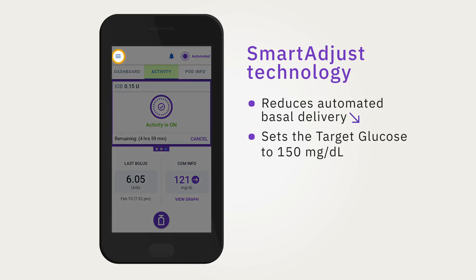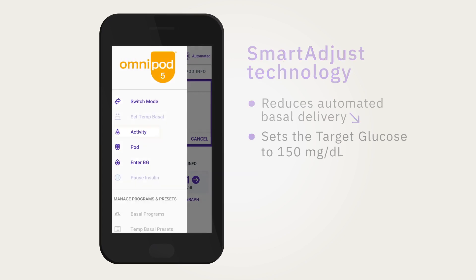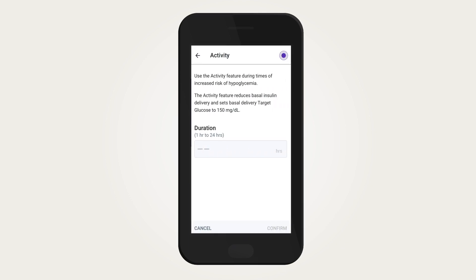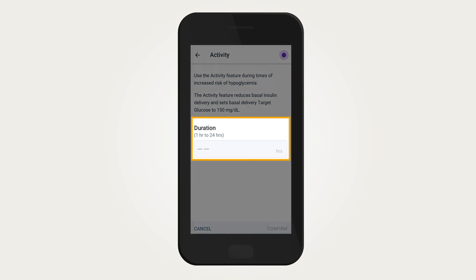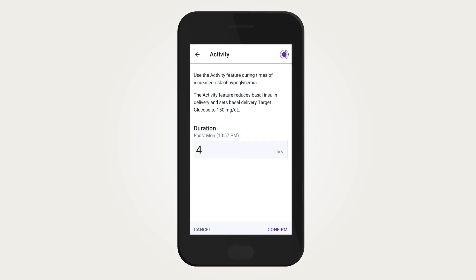To start the activity feature, tap the Menu button. Once the menu expands, tap Activity. The activity feature can be set from 1 to 24 hours in 1-hour increments. Tap the Duration field to enter the duration for the activity feature. Once the activity feature duration ends, the system automatically returns to regular automated mode.